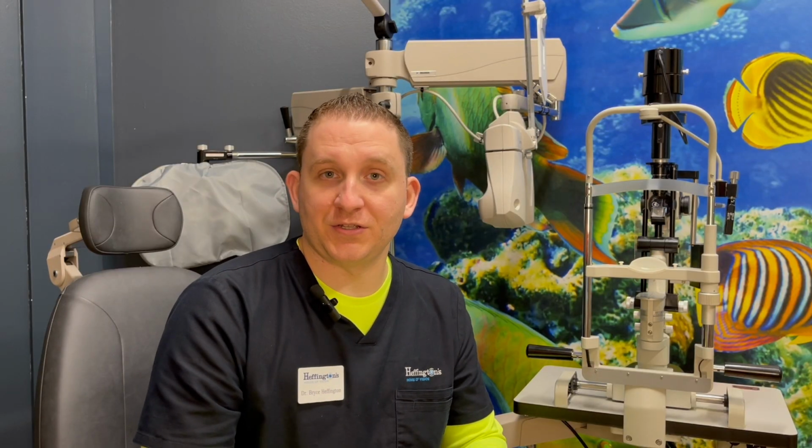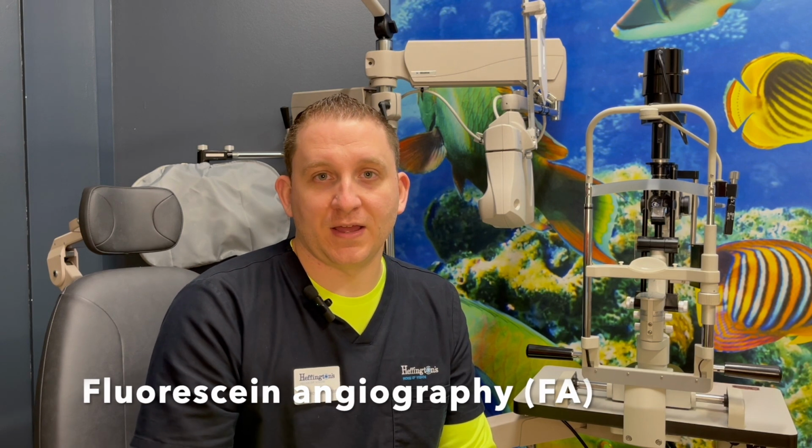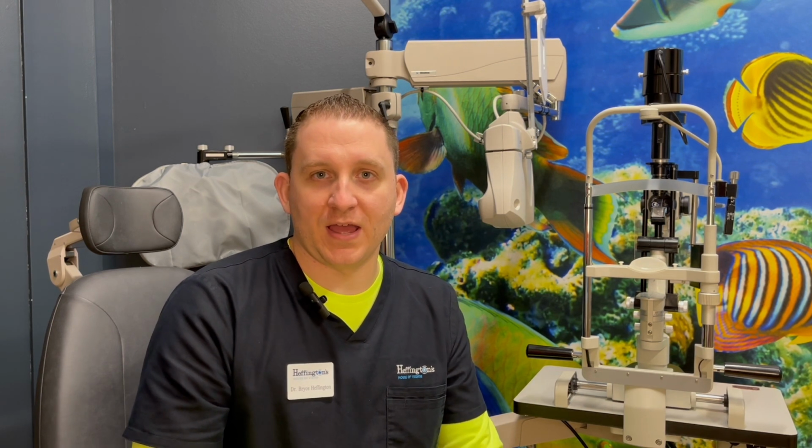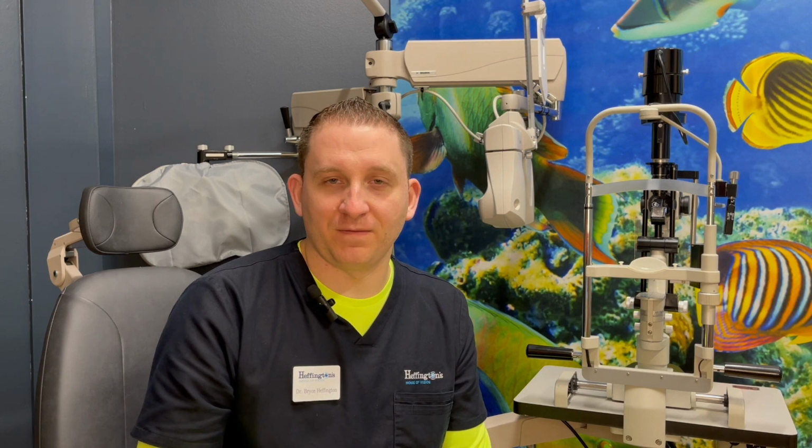And there's a whole bunch of other things you can use fundus photography for, such as fluorescein angiography, which means that this is done in certain places where you actually would have the patient be injected by the appropriate healthcare staff with some fluorescein staining dye that would travel up to the retina. And if there's any leakages or any holes in the blood vessels, you would wait probably a minute or two and then take the picture with a special filter in the fundus photography unit that would actually highlight those areas of leakage. But the technology is becoming so much more advanced that we can map the position of the blood vessels with different instrumentation we'll talk about later on this channel.